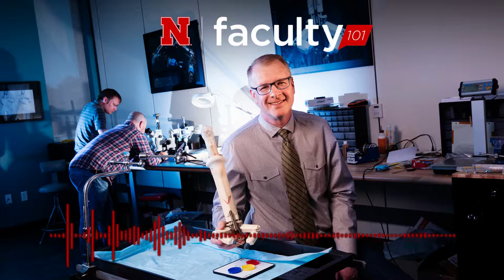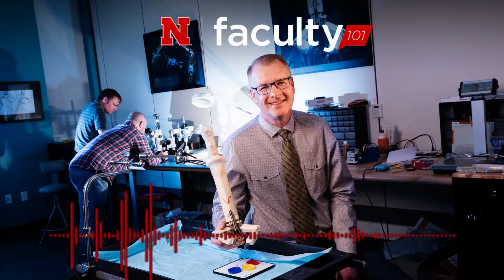So we've got one of our devices, one of our prototypes here, up and functioning. Shane Ferreter is developing miniature robots for use in surgery. The robot has a couple of arms and tools that are manipulated by the surgeon using joysticks and foot pedals. And then the surgeon uses the console here to control the device.